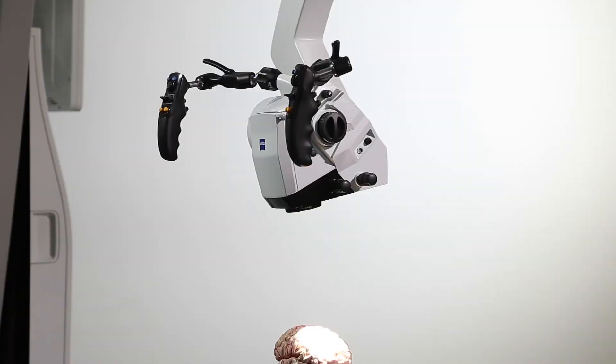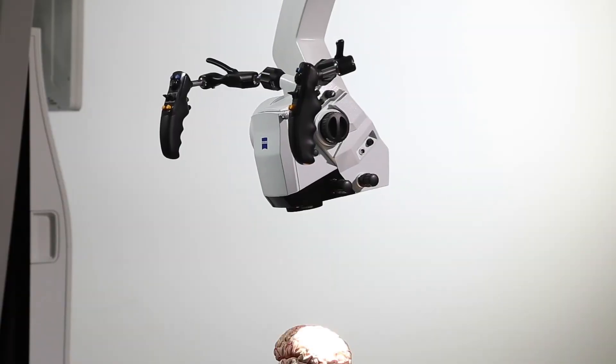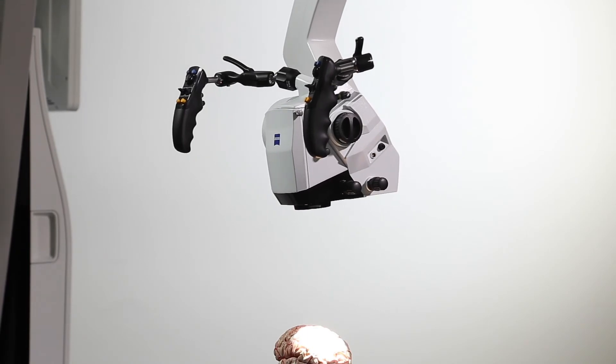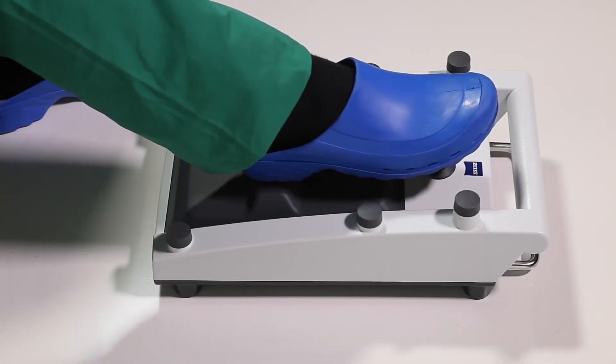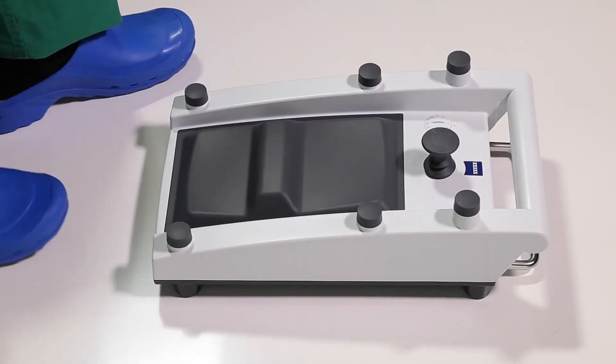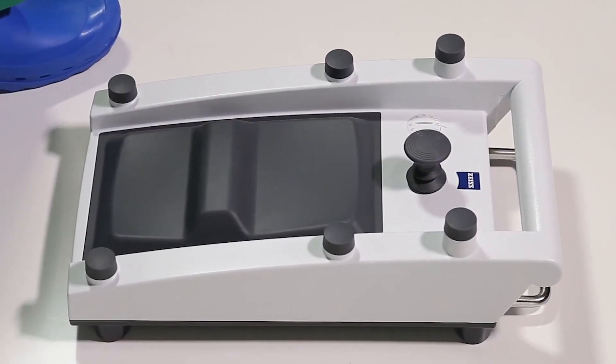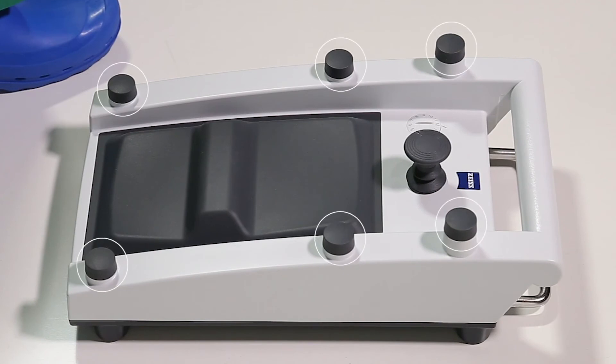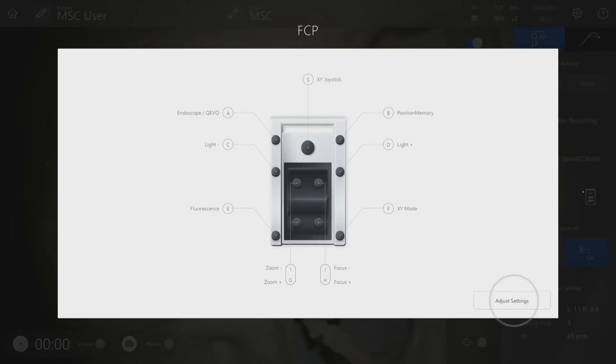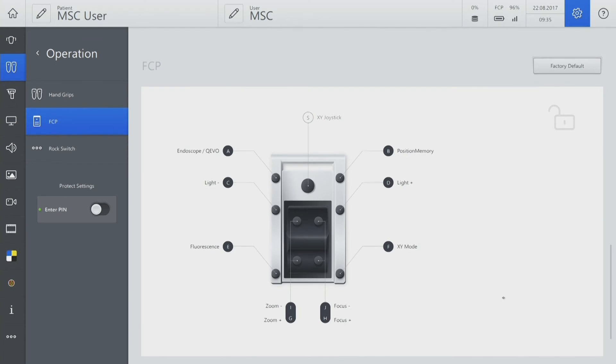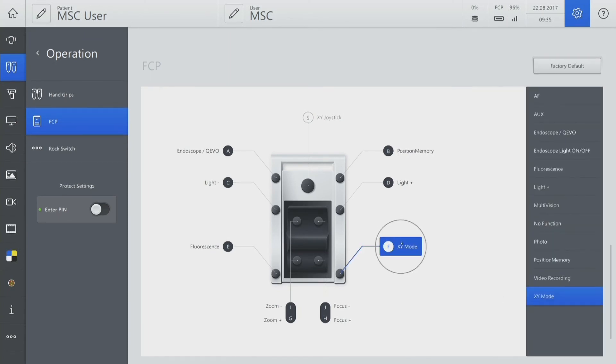For hands-free movement, you can also use the foot control panel. One of the buttons can be configured for position memory. Open the icon on the main screen, go to Adjust Settings, and configure position memory to one of the buttons.